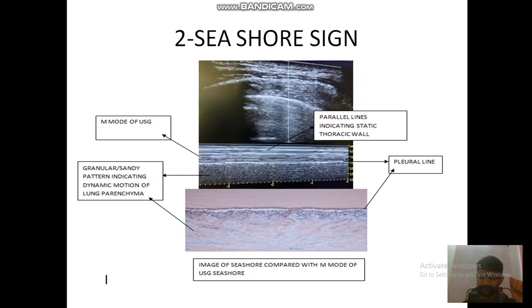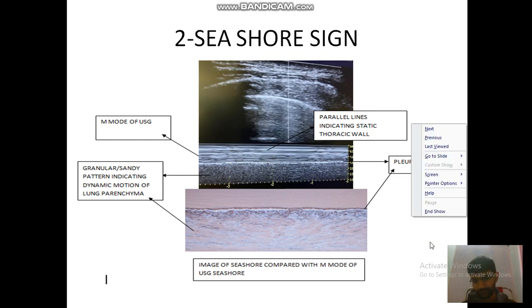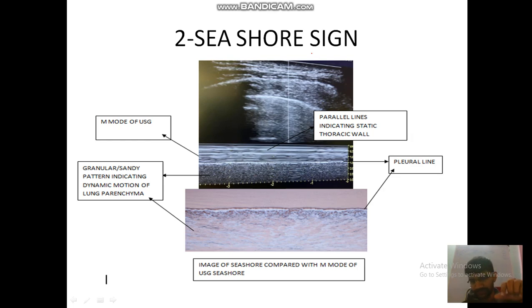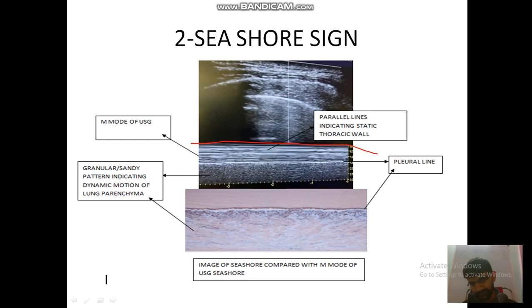Coming to the second sign — the seashore sign. It is seen in normal lung parenchyma when you turn the M-mode on. There are two images: the upper image is the ultrasound image and the below is the shore of a sea, added in parallel for comparison. The upper image can be divided into two parts. When you place the probe on the chest wall, you see the parietal pleura as a hyperechoic white line, and whatever is seen above it is your chest wall — muscles, subcutaneous tissue, skin. Below the parietal pleura is your lung.